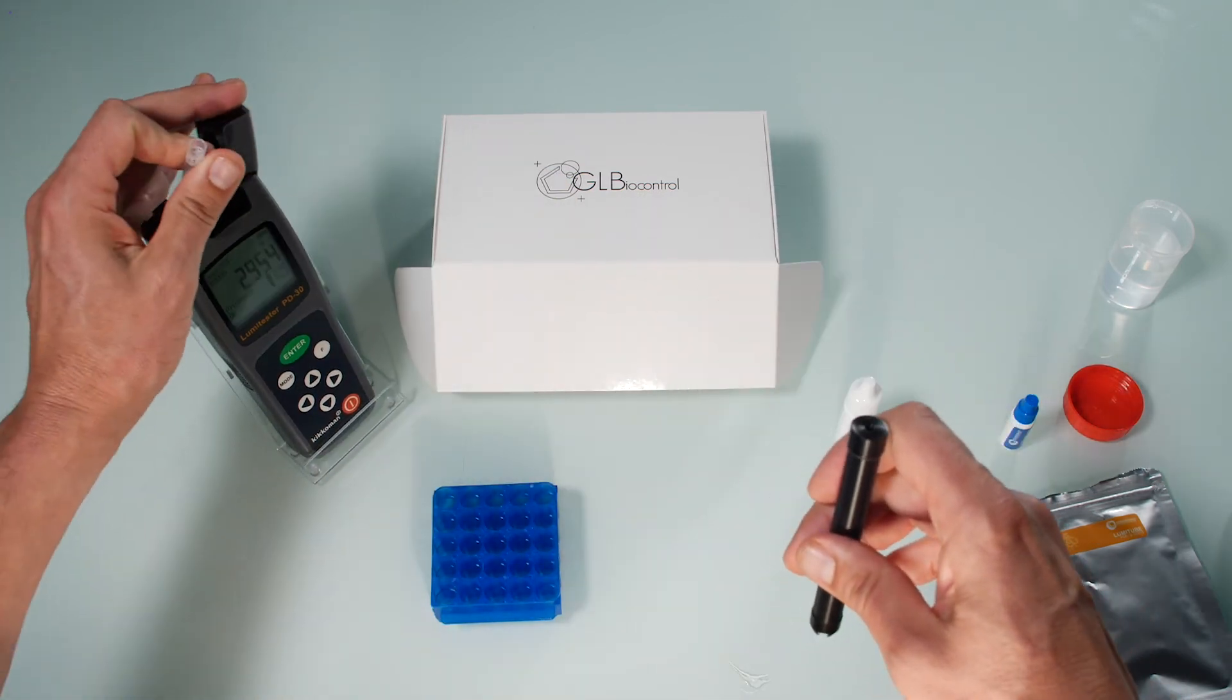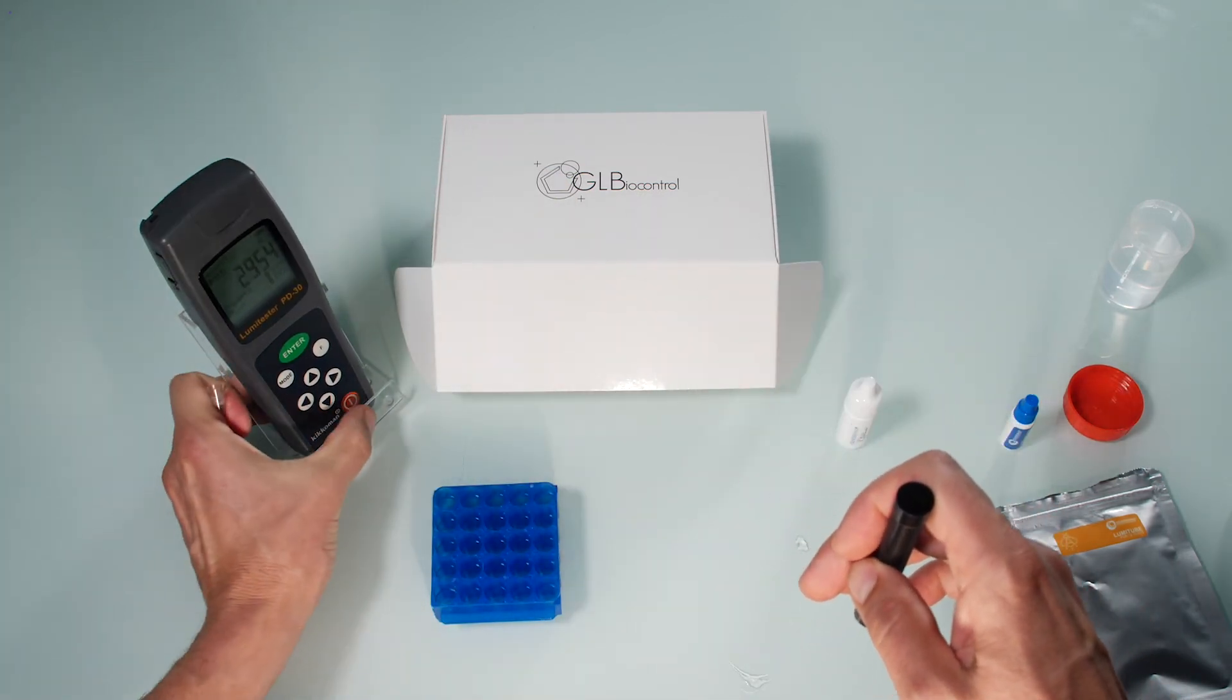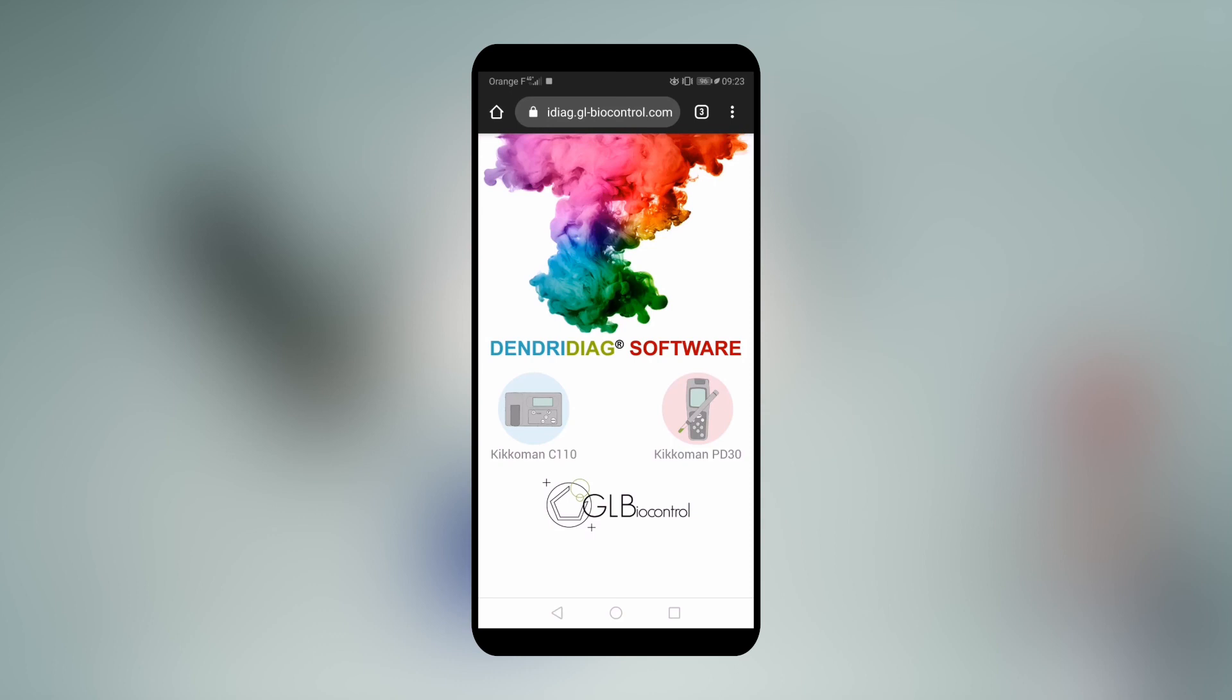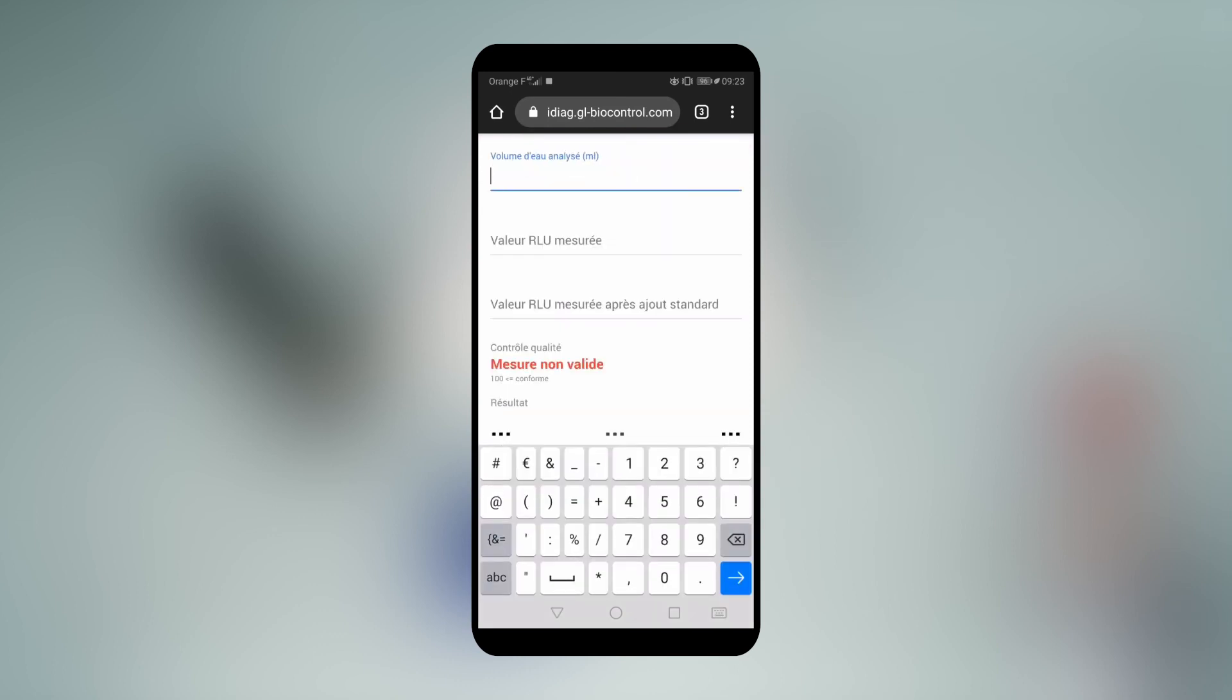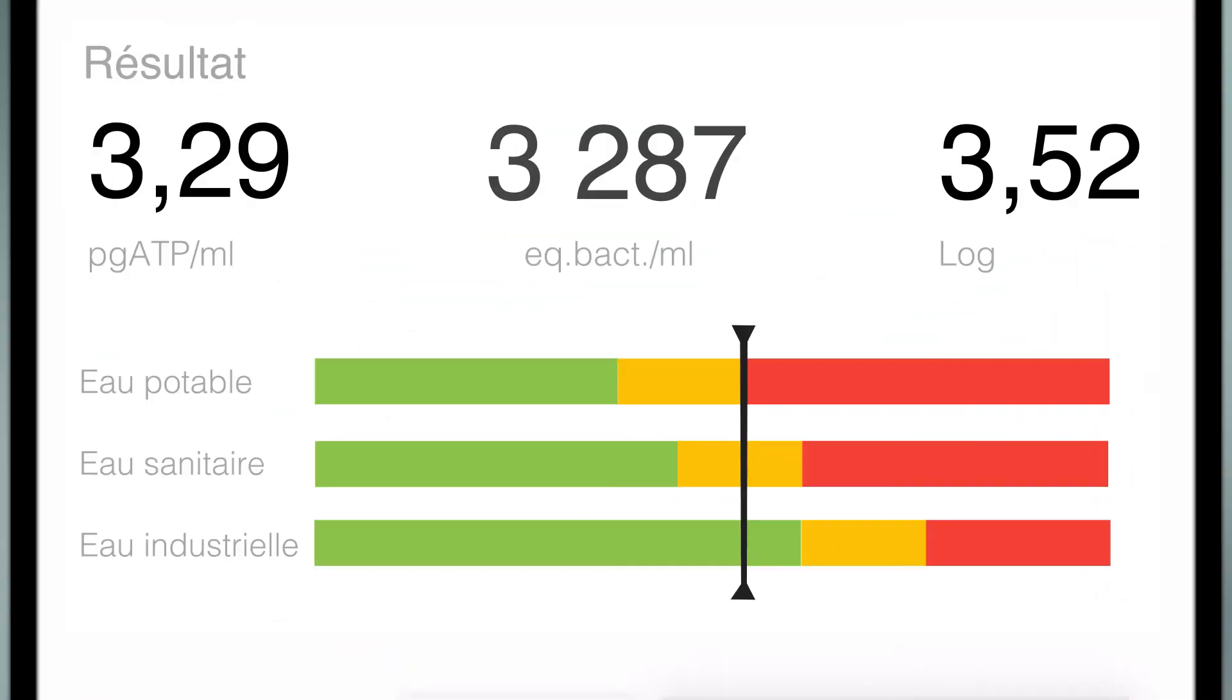Before turning off the device, remove the tube and its holder. The analysis is done. An app helps you to interpret your results directly. Enter the volume and the two results obtained. The app specifies the quantity of bacteria in your water thanks to a color code. You're informed if a corrective action is required.